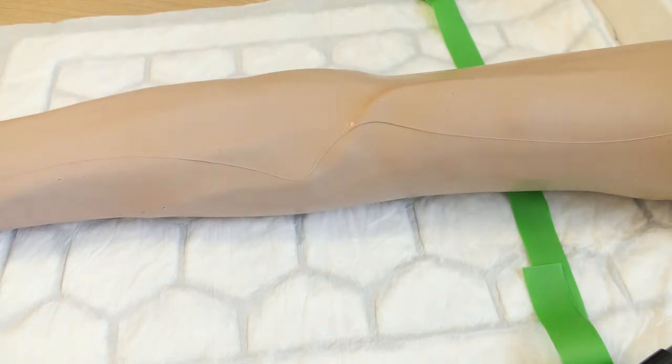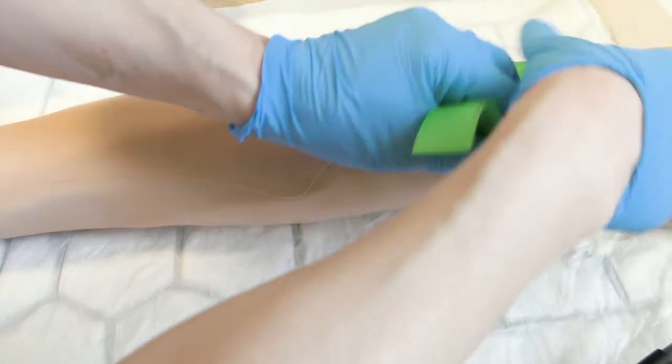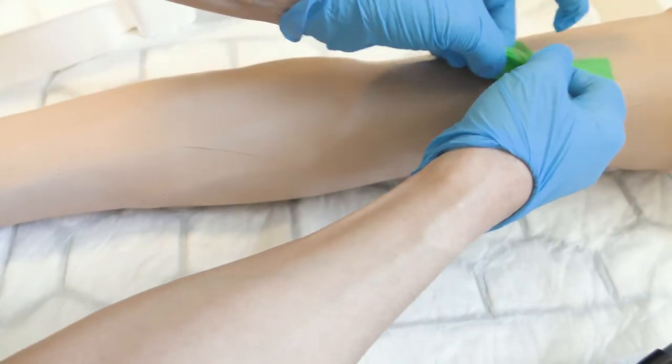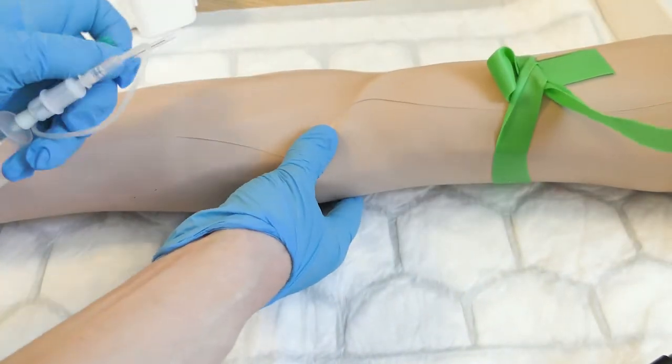Allow the skin to air dry for approximately 30 seconds. Reapply the tourniquet. Secure the skin and vein.